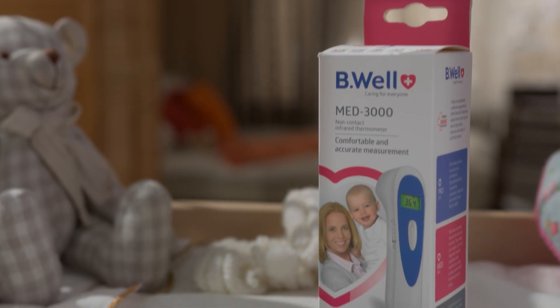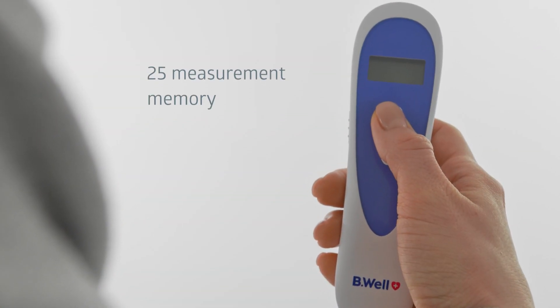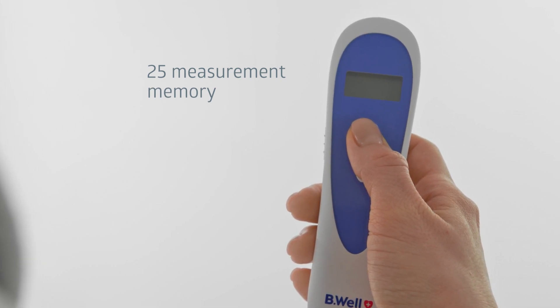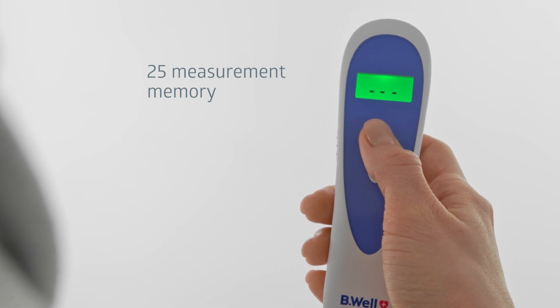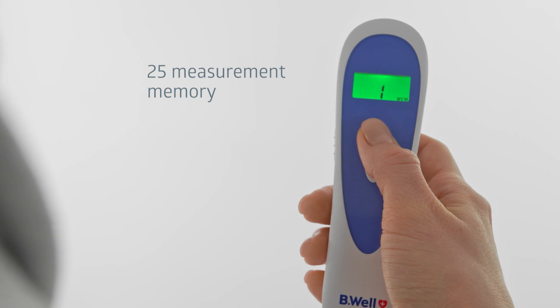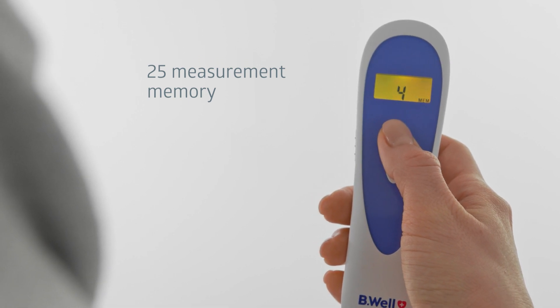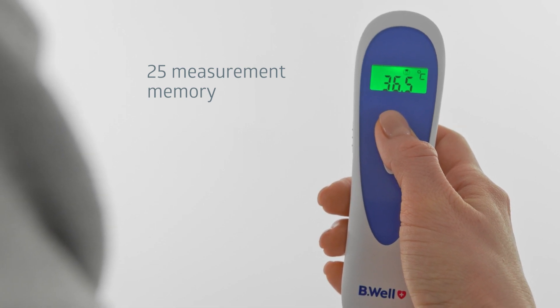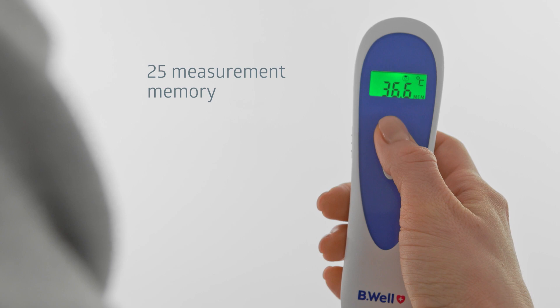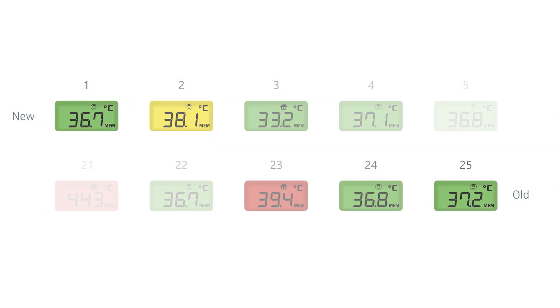The Be Well thermometer can be adjusted to your personal preference. Med 3000 has a memory for 25 measurements. To check memory readings, turn off the thermometer, then press and hold the on button for two seconds. The last result is displayed first. Each time you press the button, a result will be displayed in order of dates together with MEM and a number from 1 to 25. After each saving, the icon of a smiling face or little house on the display corresponds to either body mode or object mode. When the 25th memory cell is filled, the newest 26th measurement will be saved and the oldest will be automatically deleted.